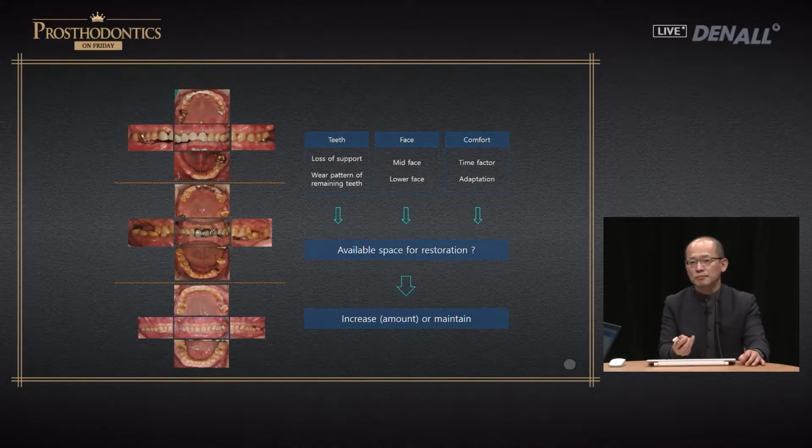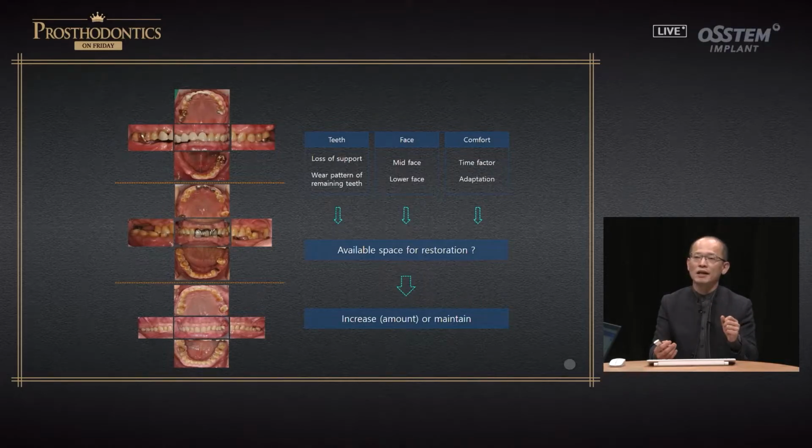Then that would make things a lot easier. In terms of rehabilitation, a sufficient full restoration is key. As I said before, aesthetic consideration needs to be made, and whether it is comfortable for the patient is also key. Yes, clinically securing VD and setting the occlusal plane is important.